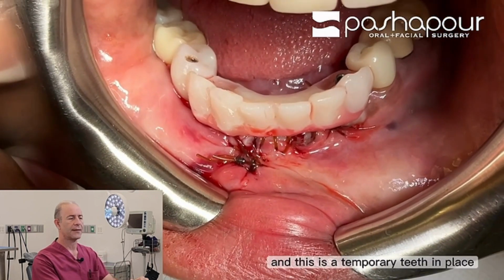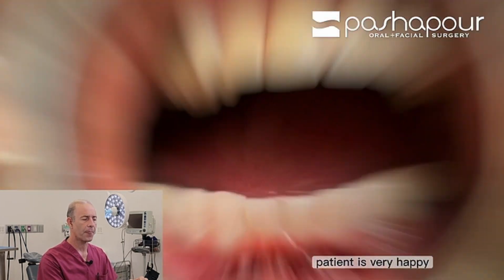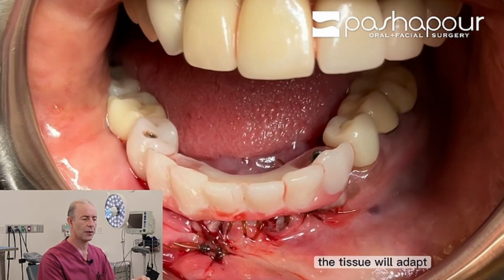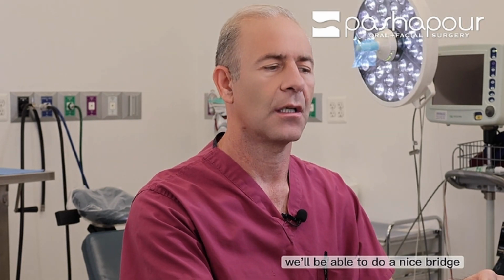And this is the temporary teeth in place. The curvature looks good. Patient is very happy. And this is just a temporary. So we come back, the tissue will adapt to the temporary, and after a few months we'll be able to do a nice bridge including all 3 implants.